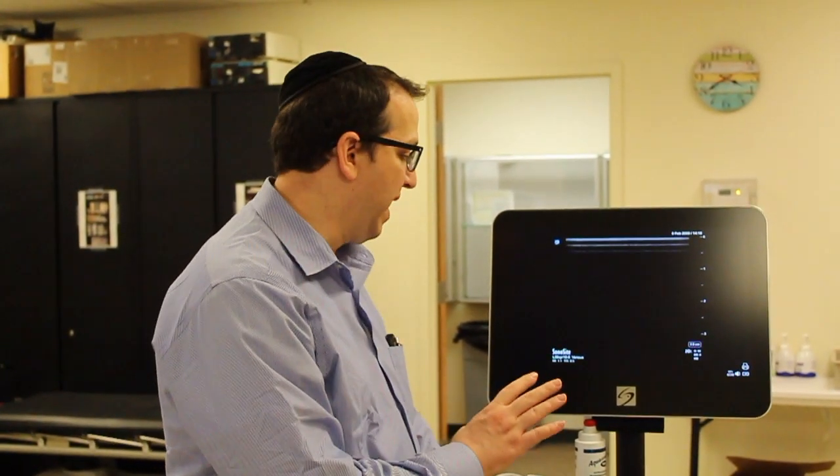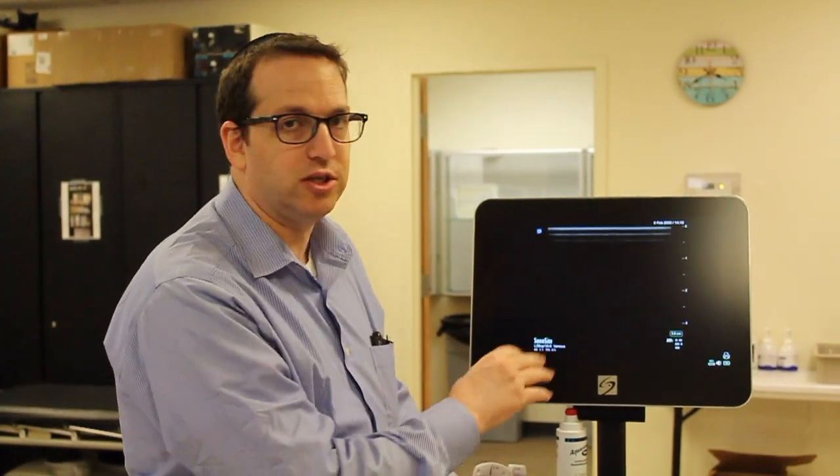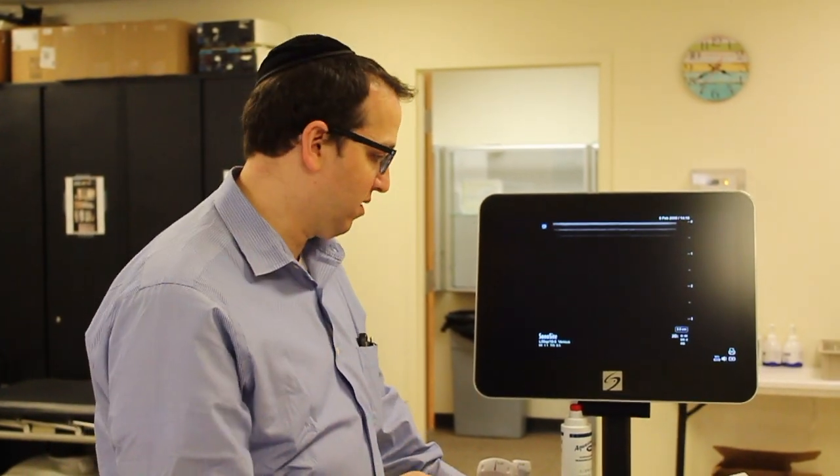This is going to be just a brief introductory video into some of the very basics of our SonoSite ultrasound machine. I'm not going to go into a whole lot of detail. You guys are going to be learning more about ultrasound in your instrumentation course. But I want you to be familiar enough with some of the very basic functions so that you can get in here on your own, know how to turn on the machine, select a probe, and make some basic adjustments to settings to be able to review and practice on your own before you're tested on the material.